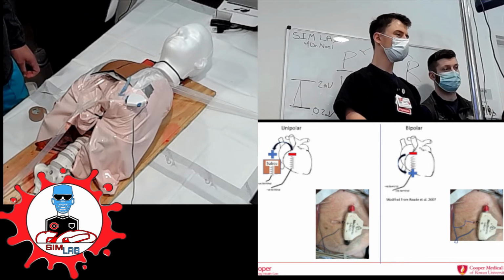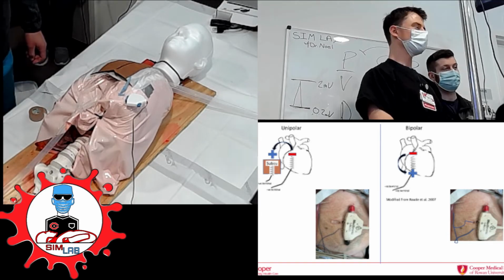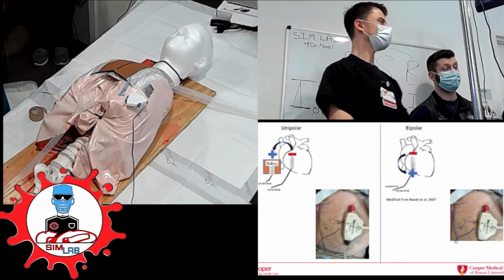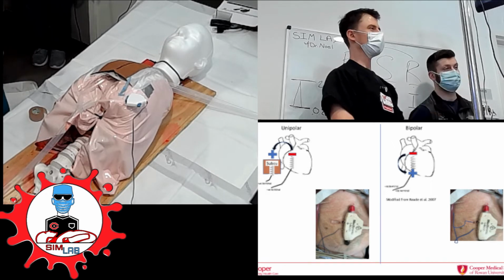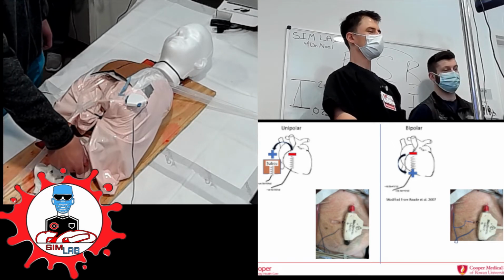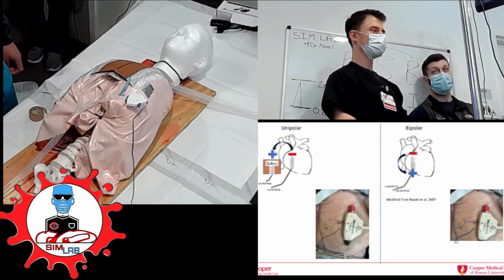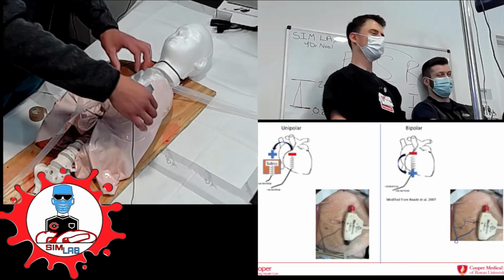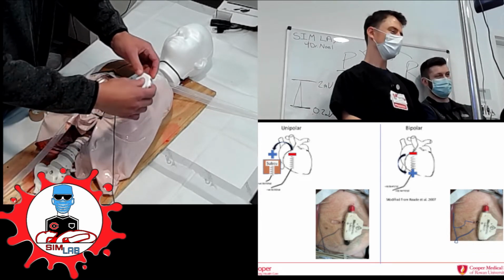So it didn't work. Well, what did you just do the step before this? Took this out of there. Oh, before that. Switch polarity. Oh yeah, switch it again. Switch again? With the needle? Yeah. Okay, I can do that.